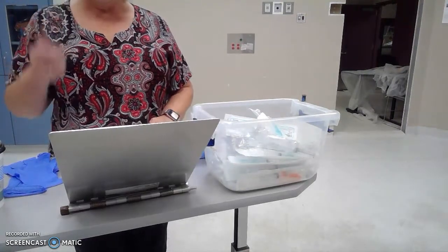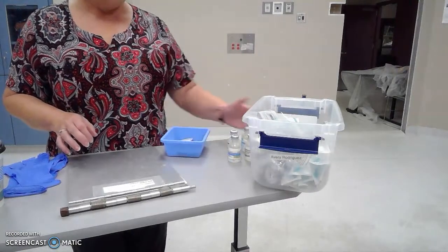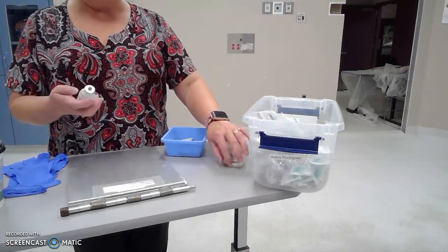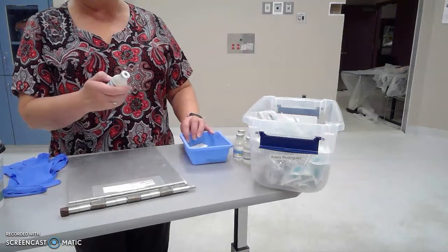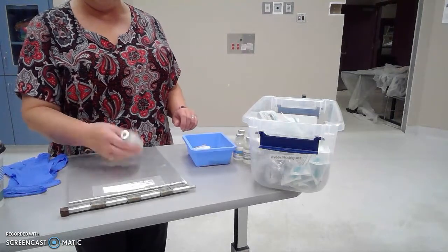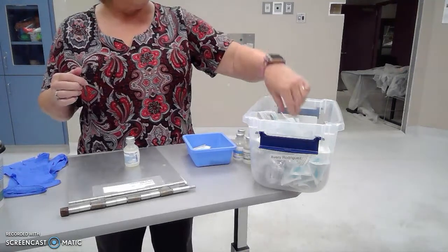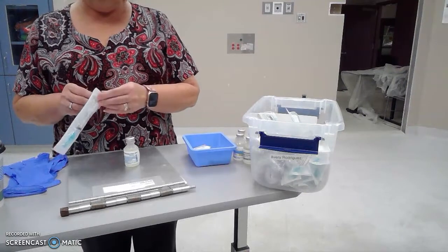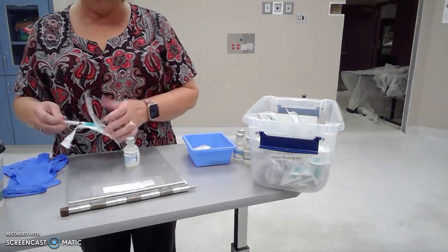So the first thing you're going to need to do is, from your selection of medications, find your Benadryl. You're going to need to look and see that it's 25 milligrams per milliliter. So I'm going to pull up 1 milliliter of Benadryl. I'm going to wash my hands and I'm going to select a needle that I can pull up my medication in.